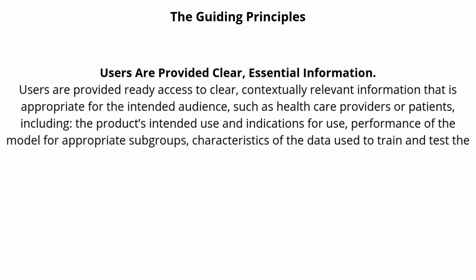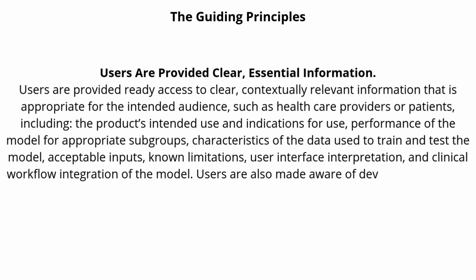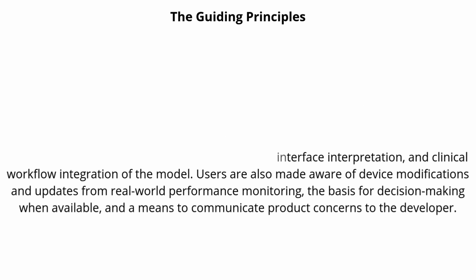of the data used to train and test the model, acceptable inputs, known limitations, user interface interpretation, and clinical workflow integration of the model. Users are also made aware of device modifications and updates from real-world performance monitoring, the basis for decision-making when available, and a means to communicate product concerns to the developer.